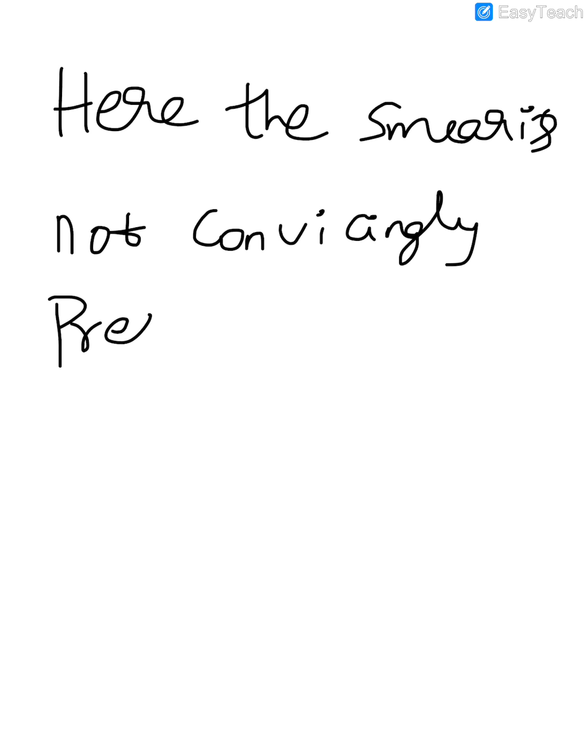That is, either the smear has more cellularity or less cellularity, which is not significant enough to make a confirmed diagnosis. So the thyroid lesions that fall under category 3 are named atypia of undetermined significance or follicular lesions of undetermined significance.